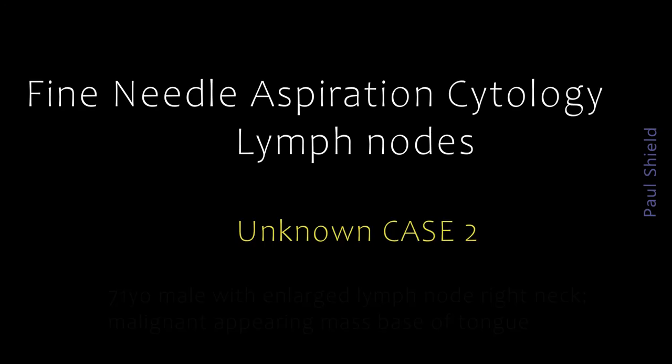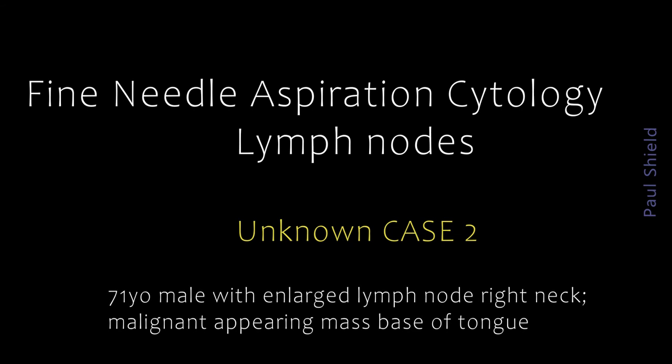This is an enlarged lymph node in the neck in a 71-year-old male. And the clinical note said that radiologically he had a malignant appearing mass at the base of the tongue.